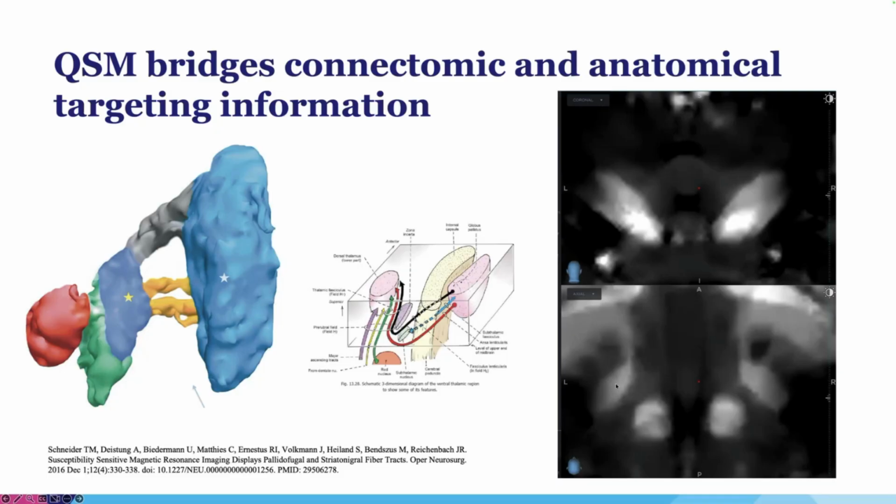As an anecdotal statement, there was one patient that had a very long STN. The ansa was quite a distance from these fibers over here. Typically when you place an electrode here with a VTA of about 3 milliamps, you're able to get into all of these particular fibers.